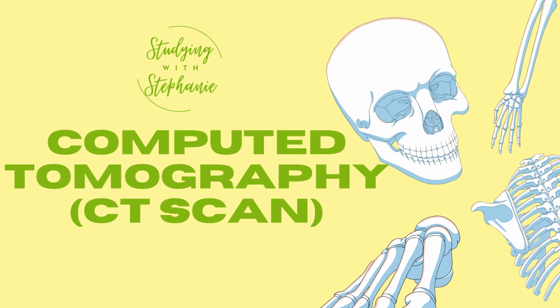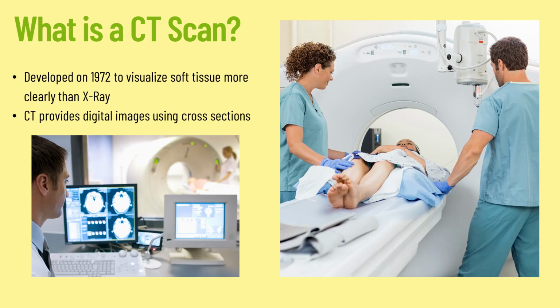Today we're going to continue our diagnostic imaging series, and we're going to discuss computed tomography, or CT scans. So let's get into it. So what is a CT scan?